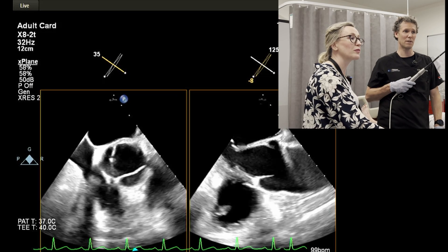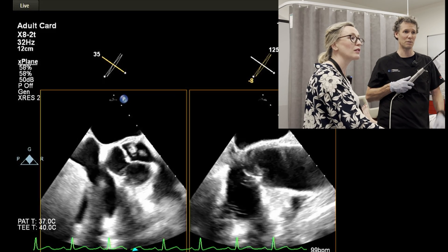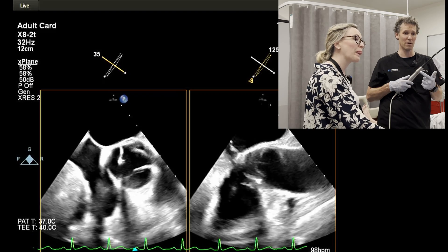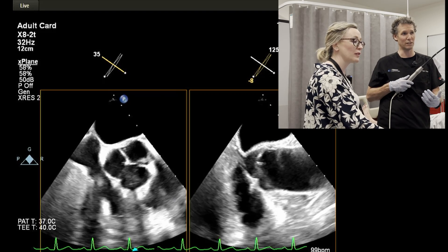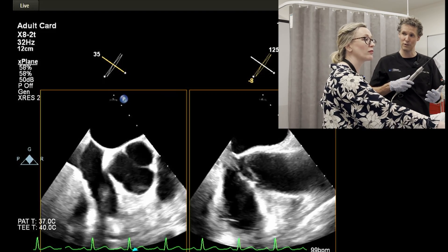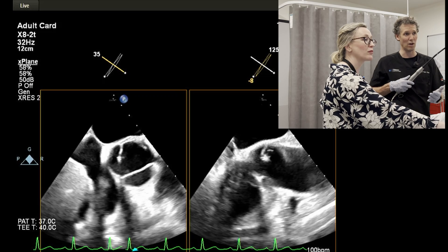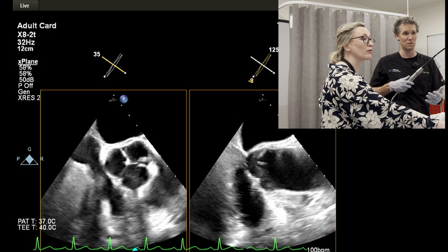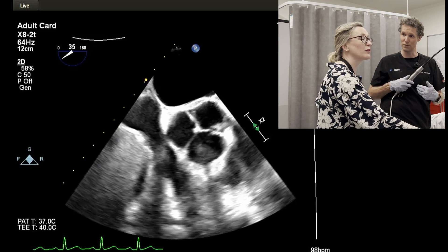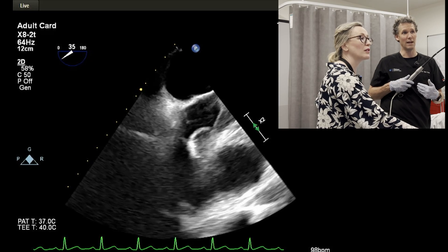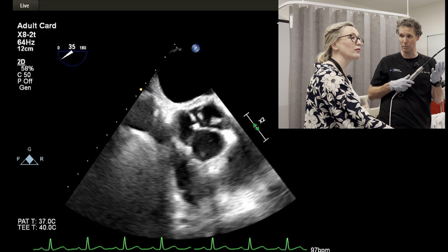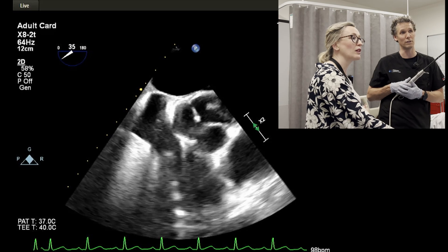So to summarize the aortic valve views: we've got our deep gastric views at zero degrees with anti-flexion, our 120 degrees in the gastric view trying to get alignment using the dot triangles, the 120 degrees in the mid-esophageal for the long axis, and then 30 to 50 degrees a little bit higher in the upper esophageal for the short axis.